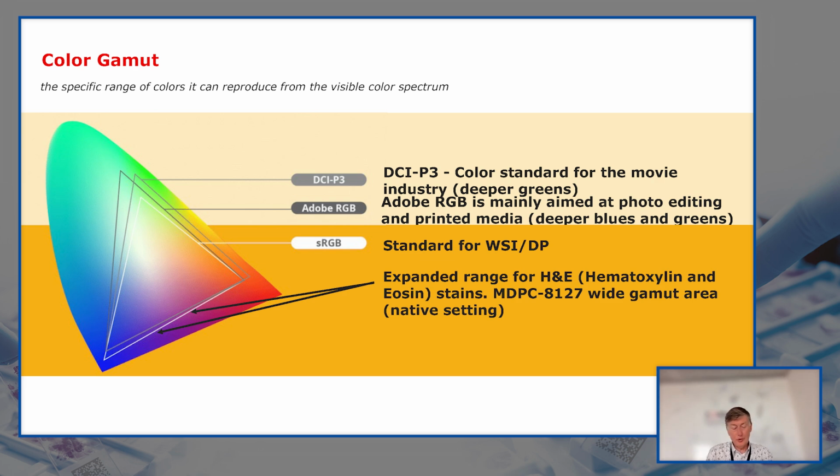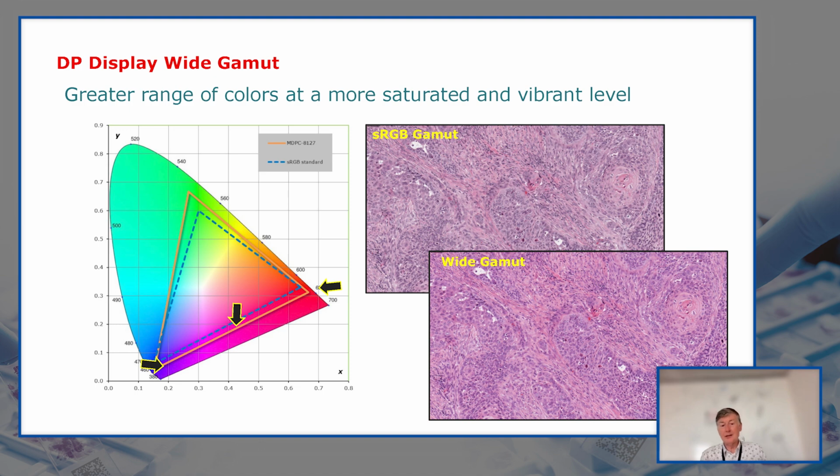And if you look to those primaries in the color space, you will have standard sRGB, which is the default also by office monitors. Now we do see a trend that there are more and more flat panels, the panels inside medical grade displays also, that allow you to go broader in that spectrum. And that is called a wide gamut display.